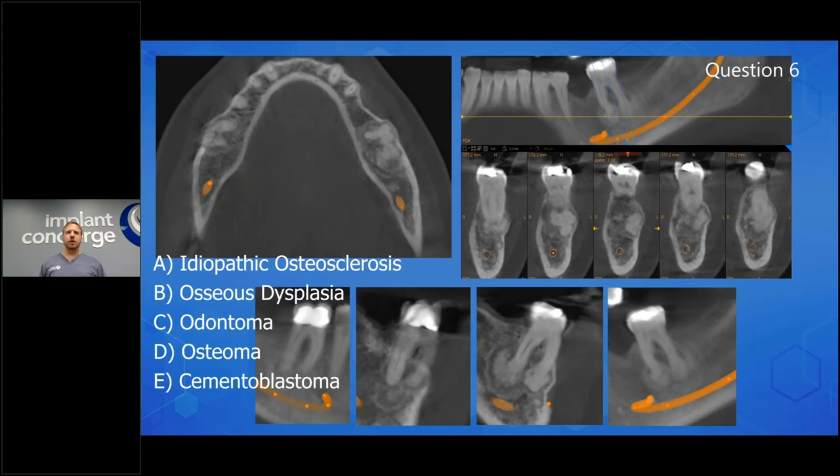Send them to the oral surgeon. I don't want to say waste their time, but get them scared. How many people have dental anxiety, and now they're in a chair at the oral surgeon's, also finding out what's going on here, versus taking a cone beam CT where you can see so much information.